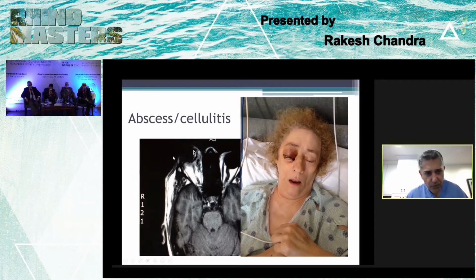So now I'm going to switch to a different case where this patient has orbital abscess and cellulitis. Interesting. This MRI demonstrates very nicely how, if you look at the normal eye, there is that physiologic tortuosity of the optic nerve, but when the pressure in the orbital compartment is elevated, in this case from inflammatory disease, the proptosis puts that optic nerve on stretch, and that further increases the ischemia of the optic nerve by pulling the vessels in the optic nerve sheath taut with it.